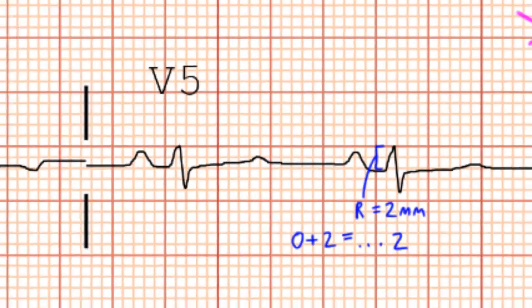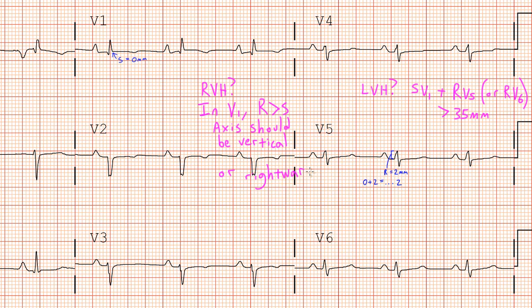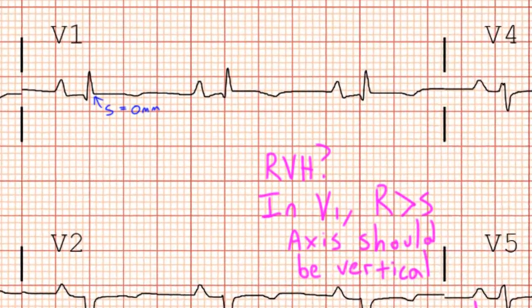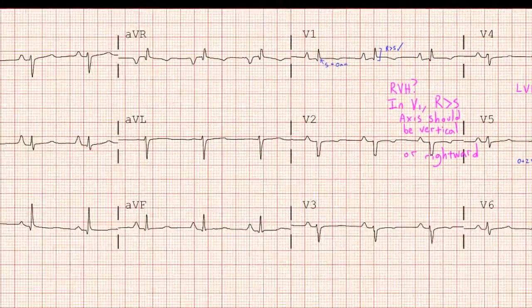Next let's look for signs of RVH. For right ventricular hypertrophy, we look in lead V1 to see if the R is taller than the S — in other words, we're looking to see if the QRS complex is generally positive. Additionally, in the frontal plane, our QRS axis should be vertical or rightward. Looking here in lead V1, we can see that the R wave is taller than the non-existent S wave, and the QRS complex is positive. So now we'll just look to see if our axis points vertically or rightward.